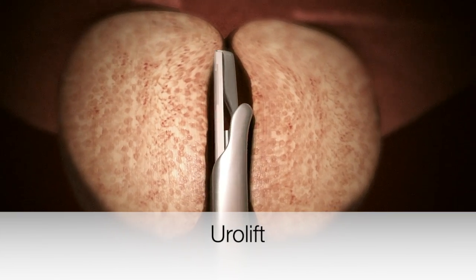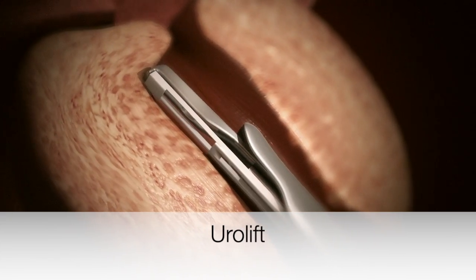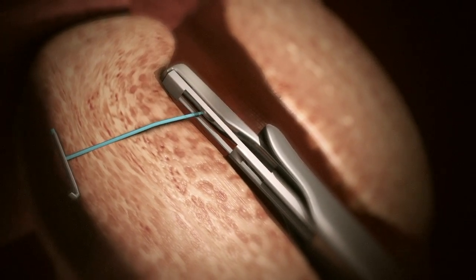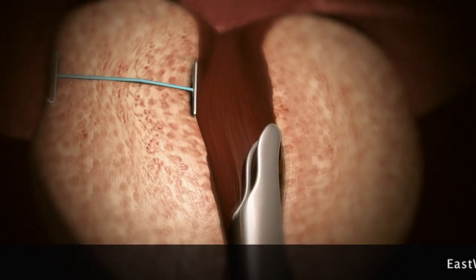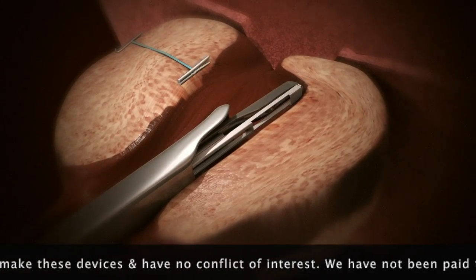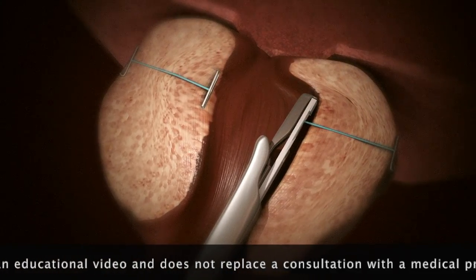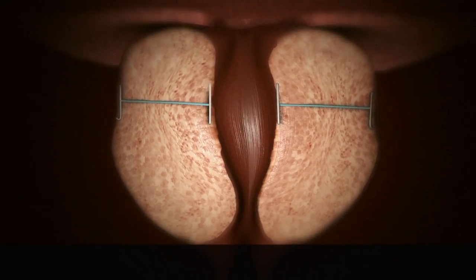The Urolift device is another surgical technique. Here a telescope is used to allow us to insert inert staples into the prostate to hold the central portion open, thereby allowing improved urine flow. These are self-tensioning and no tissue is actually removed with this procedure, and recovery is quick. The number of staples used depends on the size of the prostate and typically varies from two to four. Here you see how the staples hold open the urethra at the end of the short procedure.